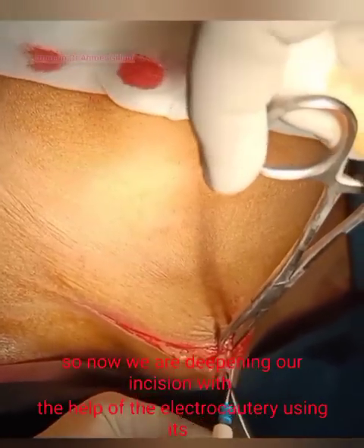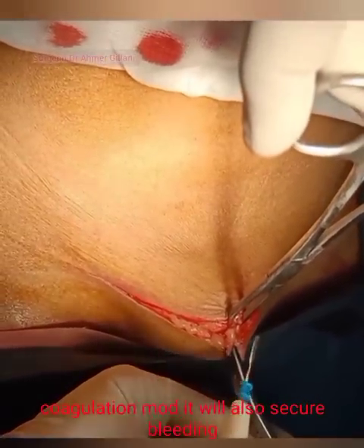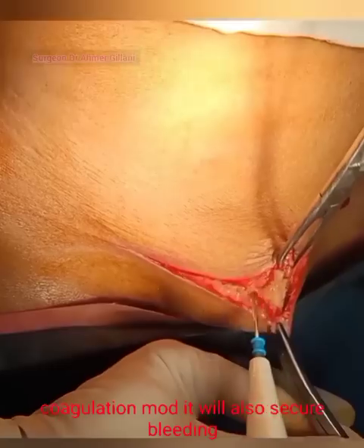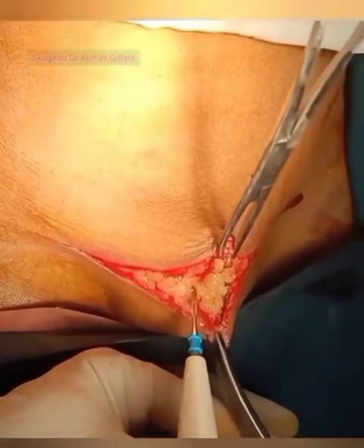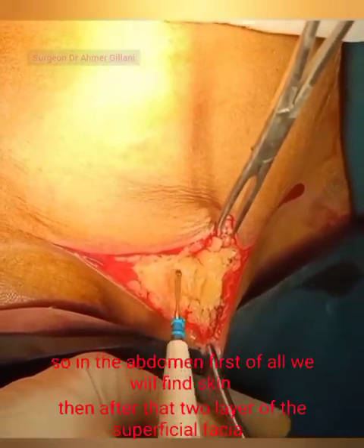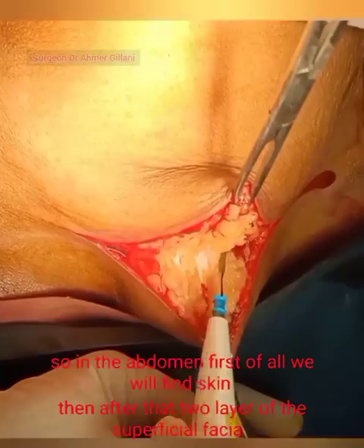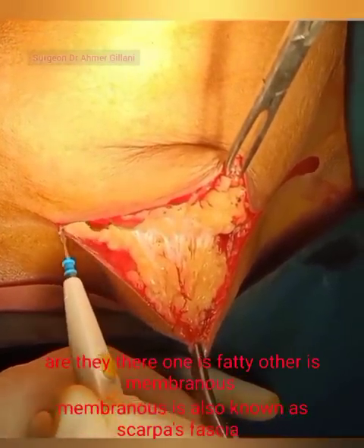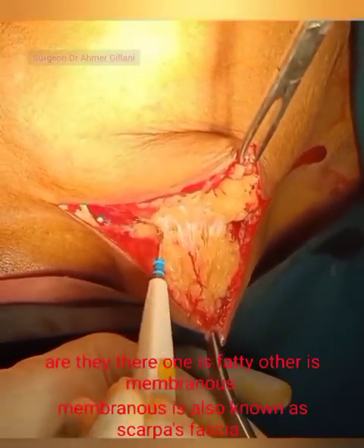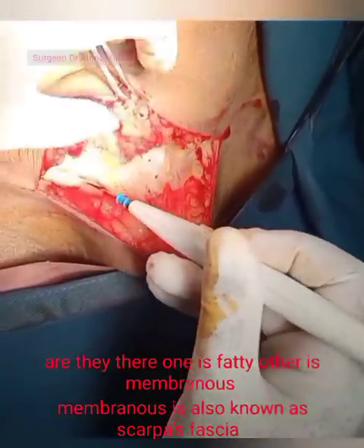We are deepening our incision with electrocautery using its coagulation mode, which also secures bleeding. In the abdomen, we first encounter the skin, then two layers of superficial fascia — one fatty and one membranous. The membranous layer is also known as Scarpa's fascia.